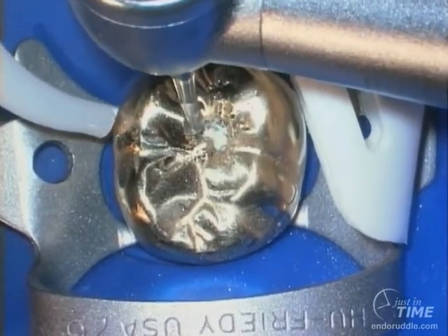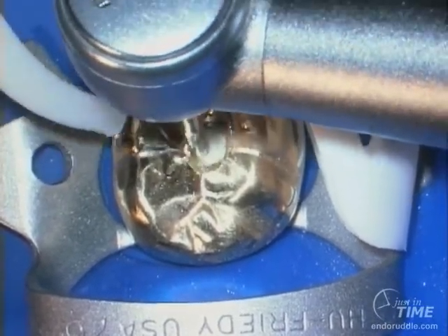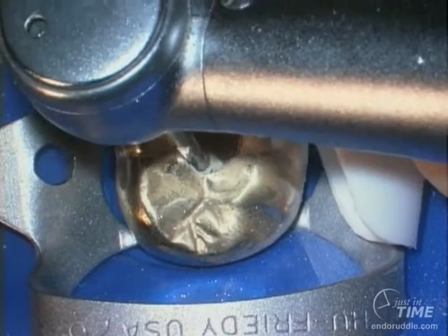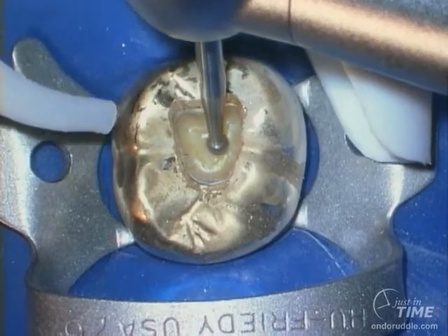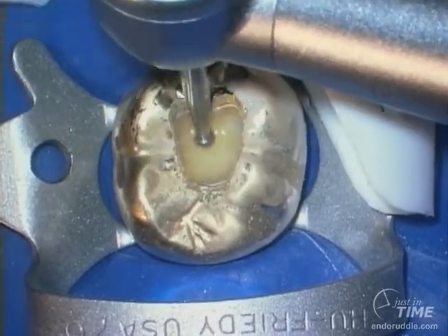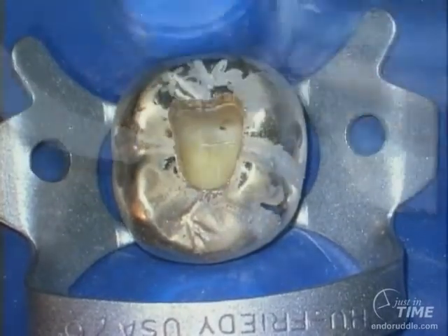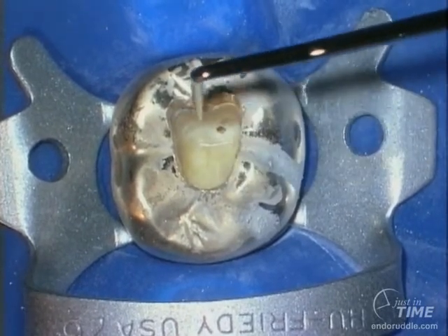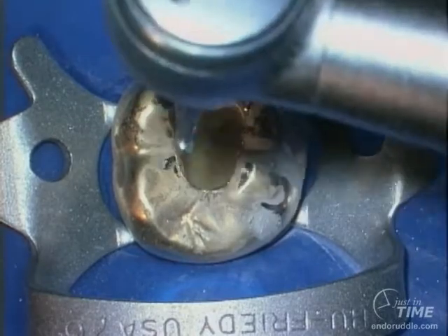Be sure to have a good finger hold because sometimes these burrs like to skip or skate when you have a metal burr on a metal restorative. You can begin to expand the access mesially and get prepared to use surgical length instruments. A surgical length number 4 round burr allows us to brush in a mesial-distal direction. The assistant can blow air through the stropco to evacuate the dust up the high-speed suction. We work progressively mesial and distal until we uncover a little bit of the pulpal chamber. Notice the access pattern — it's incomplete, but beginning to expand, and it'll be finalized once we find the pulpal floor and the related orifices.